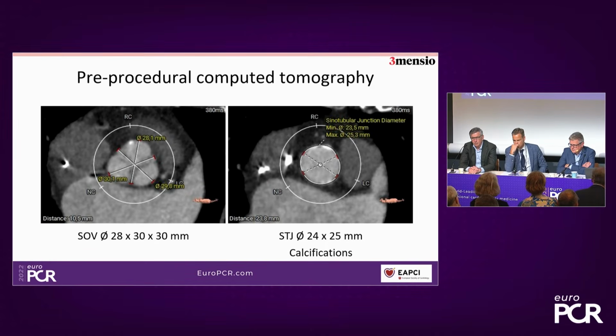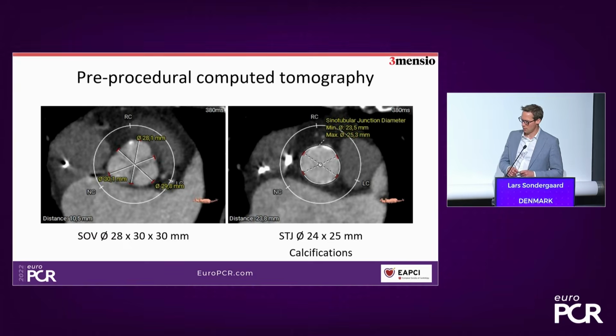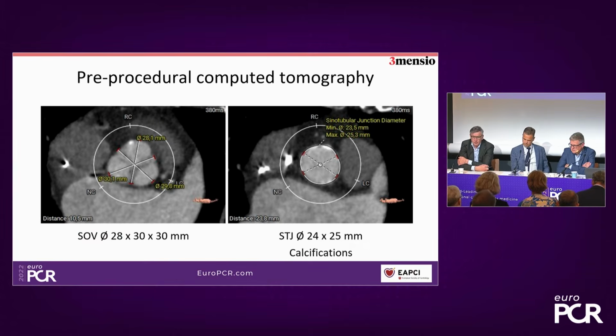Lars, in terms of your assessment, is there anything different that you do now that you didn't do in the past in terms of understanding calcium burdens, measurement of membranous septums, and so forth? Yeah, we didn't talk about the membranous septum here, but that's of course also important information, because the longer it is, the deeper you can plant the valve without the risk of conduction abnormality.